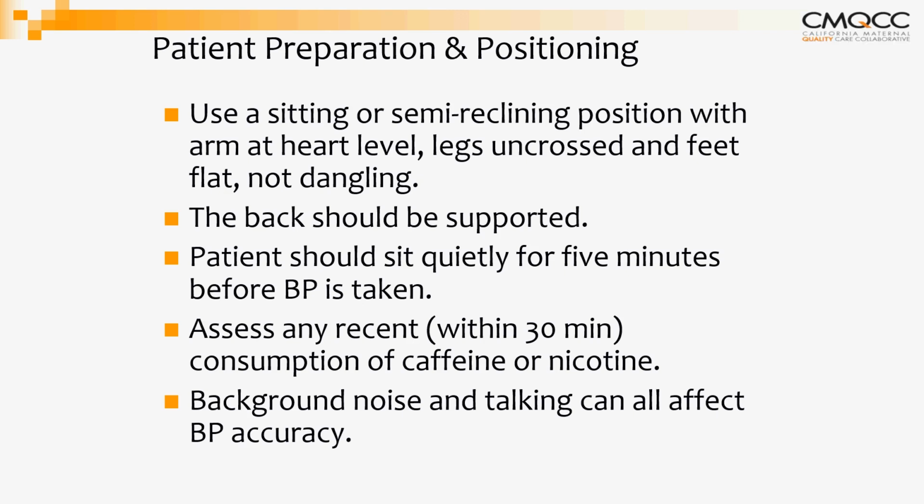So let's just go into technique, patient preparation and positioning. We, as OB nurses, can get into bad practices of how to take patients' blood pressures. I've heard and seen a range of different ways that blood pressure is taken. And you all have probably experienced this as well, that we seem to have a fear of recording a blood pressure that's elevated. There are so many ways to cut corners. So it might be laying the patient down flat. I've even heard of lowering the patient's head or taking the blood pressure on her lower arm to ensure that we get a lower blood pressure.